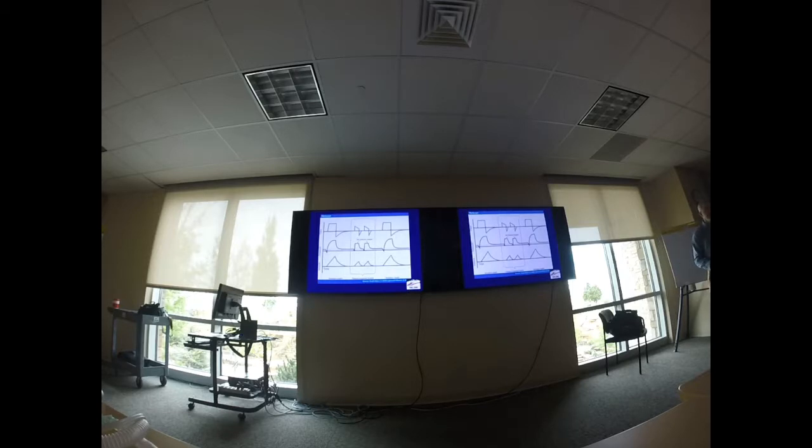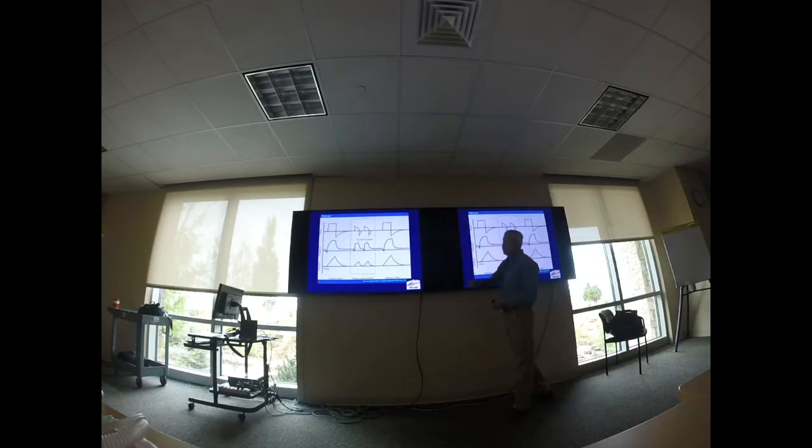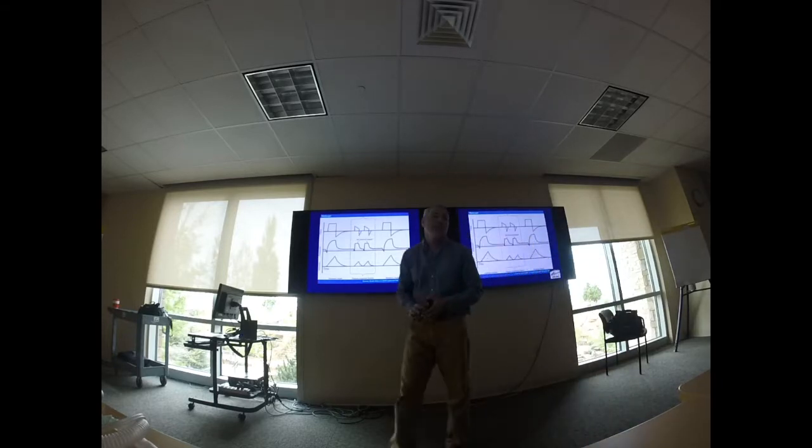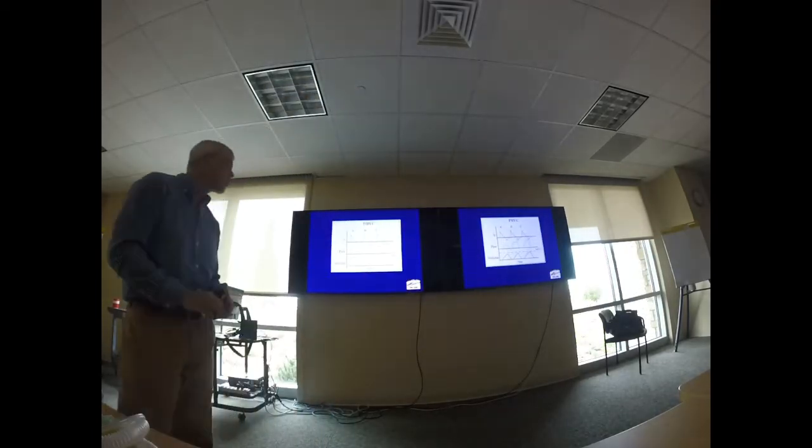whole circuit. Isn't he also taking the breath like before and after because it has a little down on the pressure? Well, this is an indication of a change in pressure, so it could just be a pressure trigger instead of a flow trigger. I don't know what the picture represents.